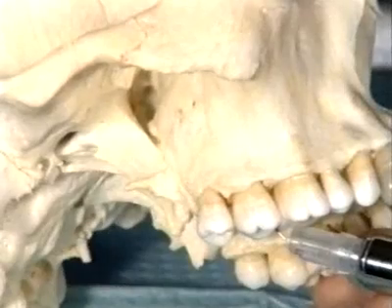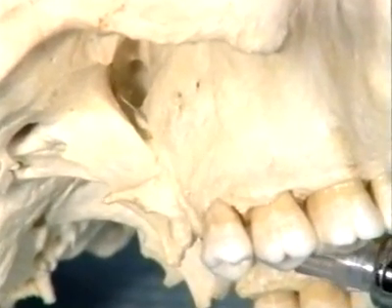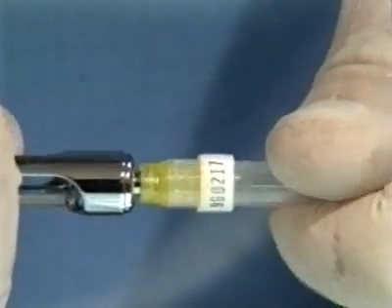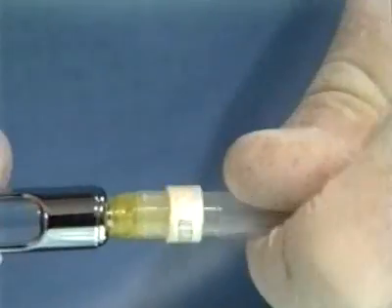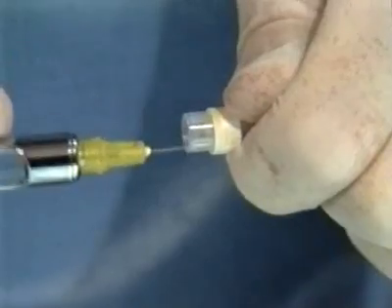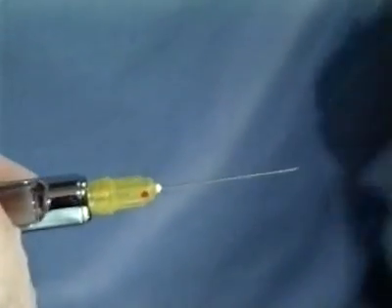When the needle is inserted to a depth of 30 millimeters for the average adult, the tip will lie 1 centimeter beneath the maxillary nerve. For this injection, a 27-gauge long needle is preferred. The smaller diameter and greater flexibility of the 27-gauge needle facilitates passage through the canal.